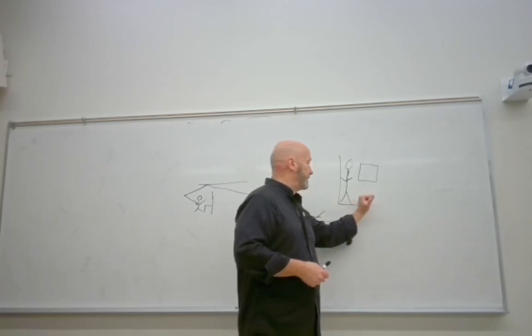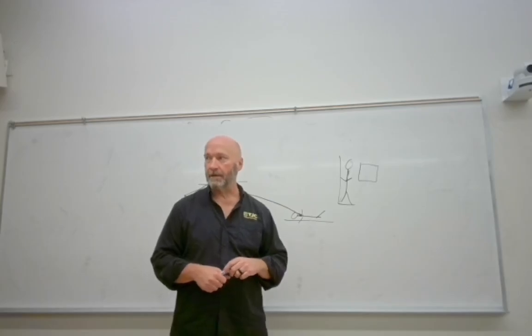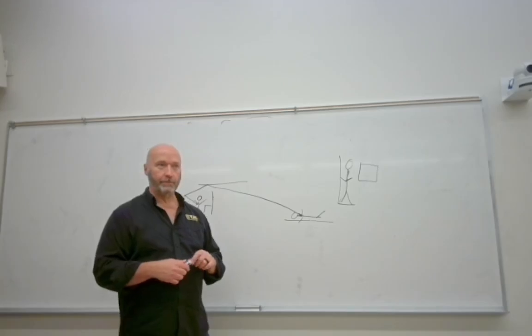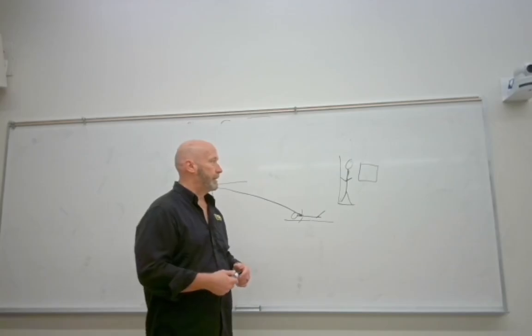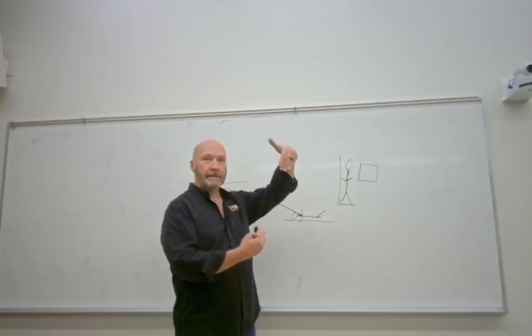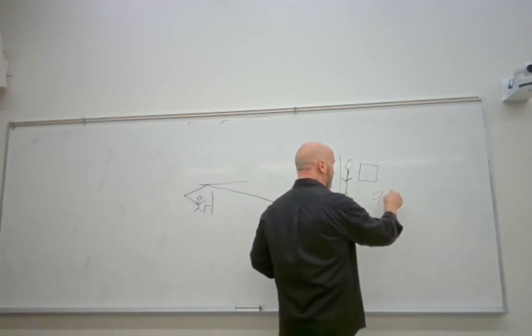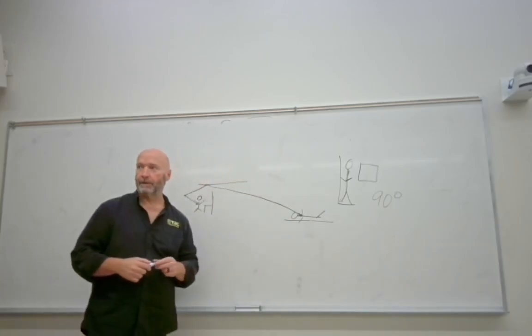The problem is, you put a patient on that and it's not locked into place. The patient steps on it, it's going to the floor, and probably the patient is too. That might land on their foot. Now you get a lawsuit, right? So make sure it's on there. But fluoro tables are going to have some degree of tilt. In one direction, they're going to go 90 degrees. In the other direction, they're not going to go so much.